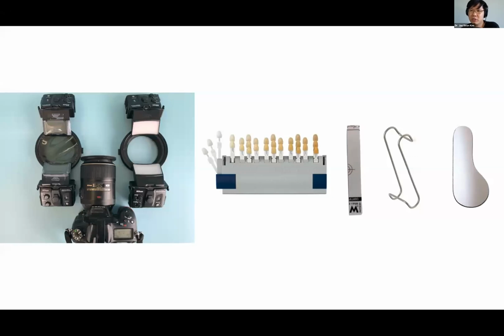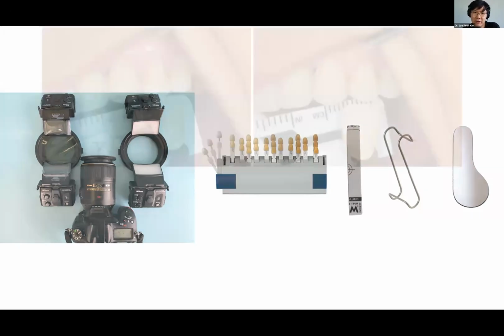Like, for example, if I'm doing a number 14 and let's say number 3 is a natural tooth, then I would take a picture of number 3, the occlusal surface and the cervical part, and then send that to the ceramist. If, let's say, all the molars are restored, then you can take a picture of the premolar. So you want to give as much information to your lab as possible so that they can mimic the amount of stain that they'll have.